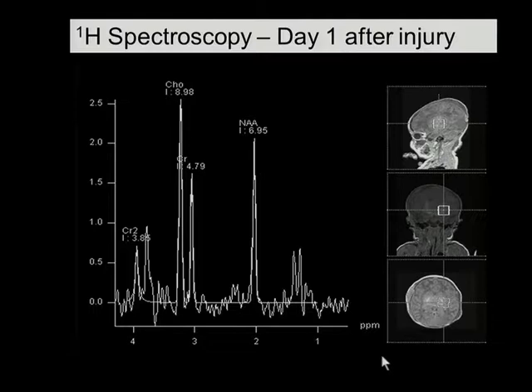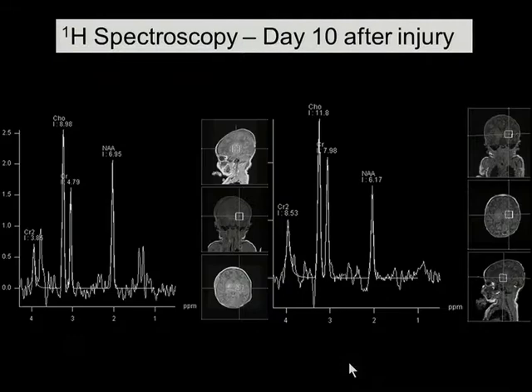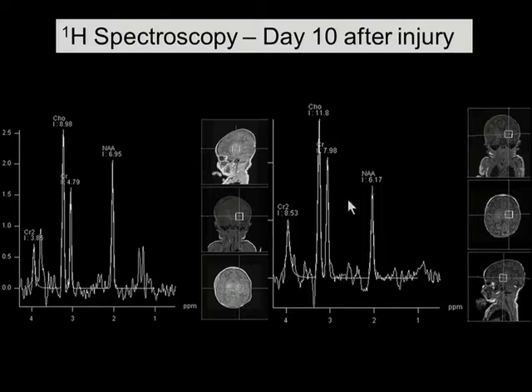Here is an infant in our own unit who underwent imaging on day one after an ischemic insult. You can see this doublet of lactate peak with a preserved N-acetyl aspartate. When we imaged this infant 10 days later, the lactate is no longer visible but the NAA peak has fallen, consistent with neuronal loss.